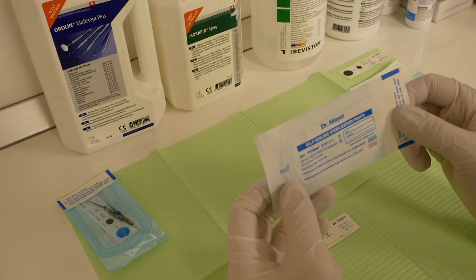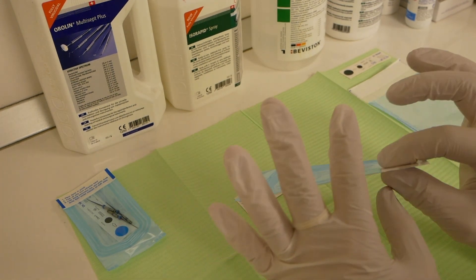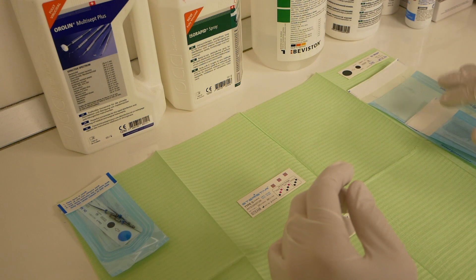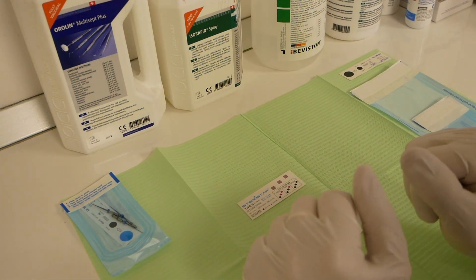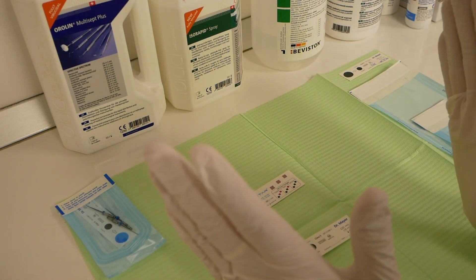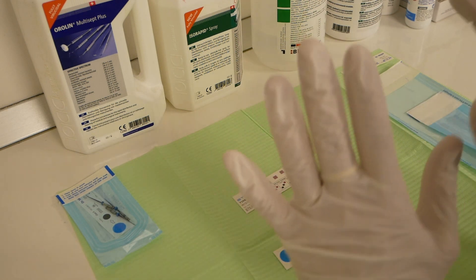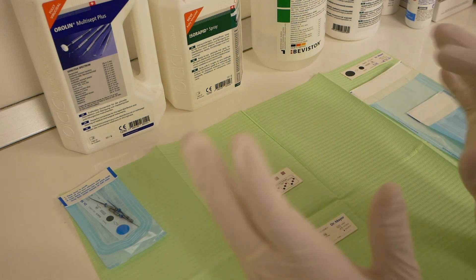The Class 1 strip just reacts to basic heat, and that's it. As you can imagine, this is not enough to ensure proper sterilization has been achieved. So basically the Class 1 indicator strip is just a good way of telling if you have processed a pouch or not — that's it.